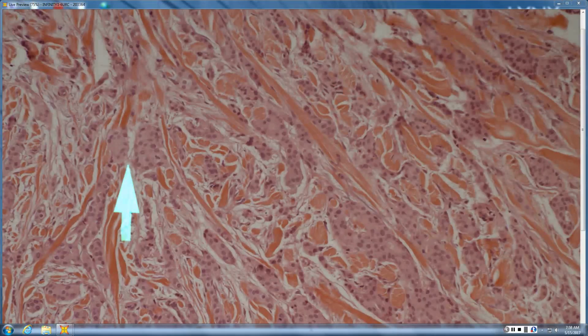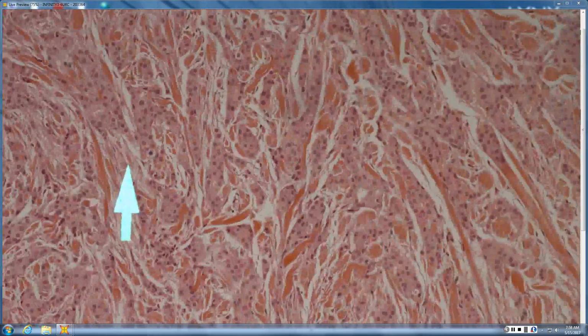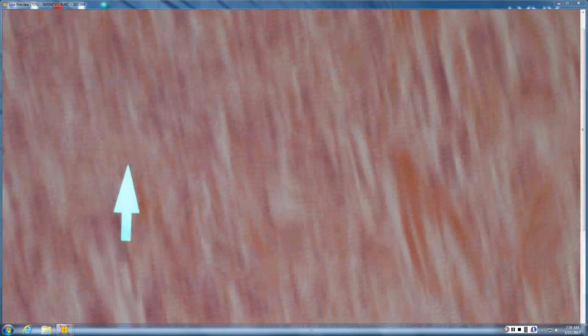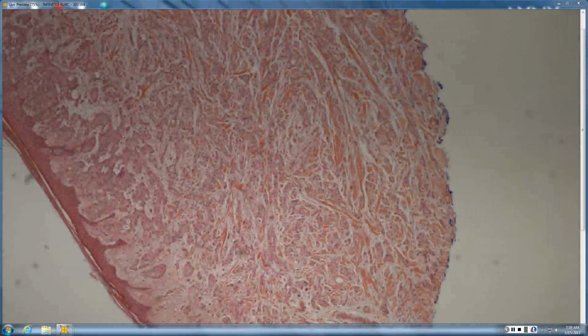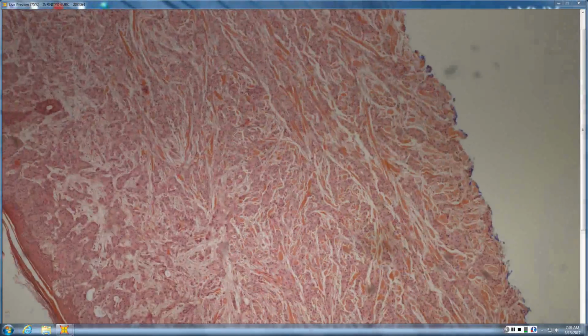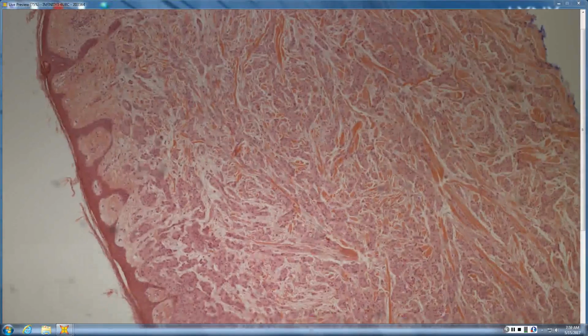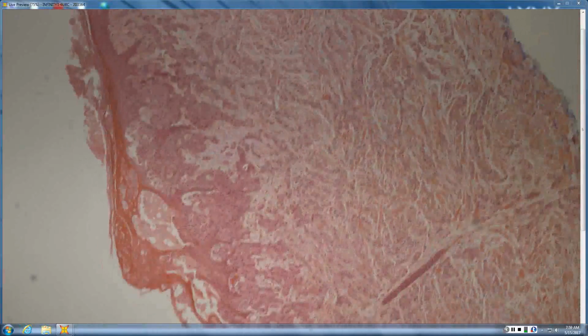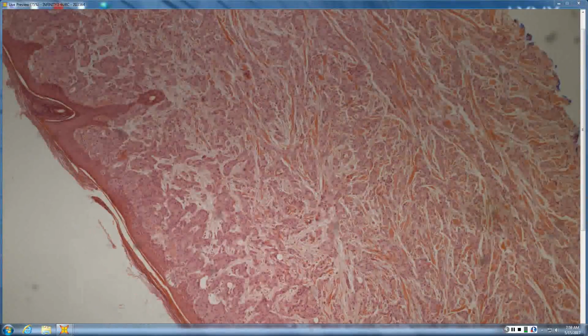There's an infiltrate in the dermis of some kind of sheets of cells, really displaying the collagen fibers. So I'd definitely have to do some stains. Agree. In some areas, it looks suspicious for adenocarcinoma with some lumen formation. You can be fooled sometimes with squamous carcinomas as well. This one proved to be metastatic breast.